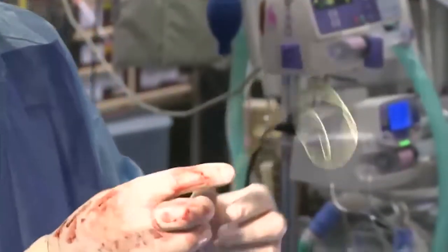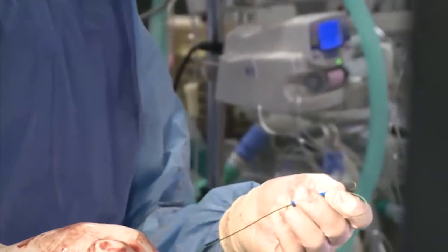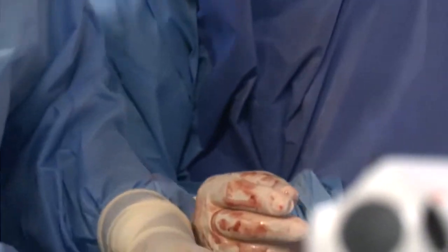Of course, this is the usual technique which we use for most of the patients. We'll go with this. I want to change it to a pigtail now. Pigtail is not in. Okay, I want a regular wire. So come to RAO, please. Regular exchange length wire.